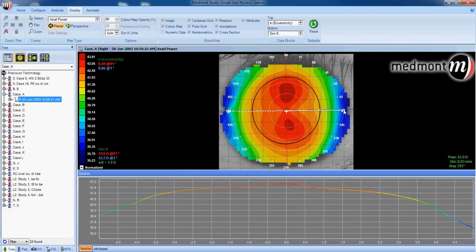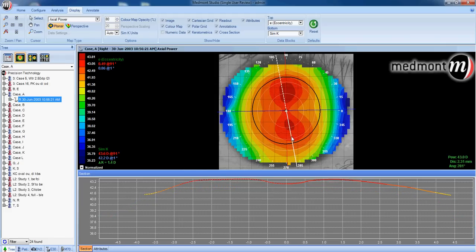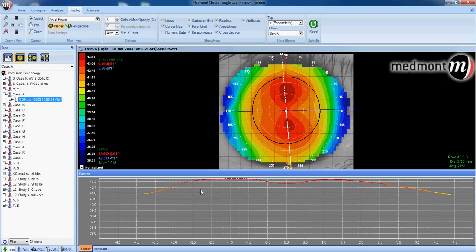Now change your axis line to the vertical meridian. And notice there's very little rate of change from center to periphery along the steep meridian as compared to the flat meridian. That gives us a much lower eccentricity value.